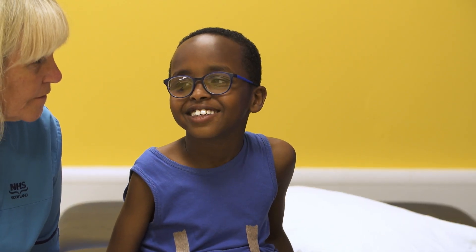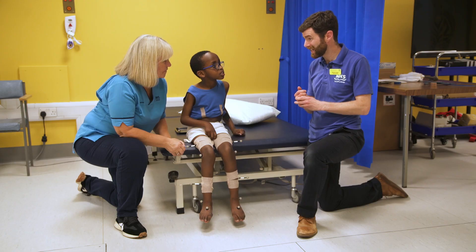You've done absolutely brilliantly. The next thing that's going to happen is we'll take all the data we've captured today from the walking, from the clinical examination, and from the chat at the start, and put it together into a report. The only thing we need to do now is for Laura to take off all the dots. Is that okay?